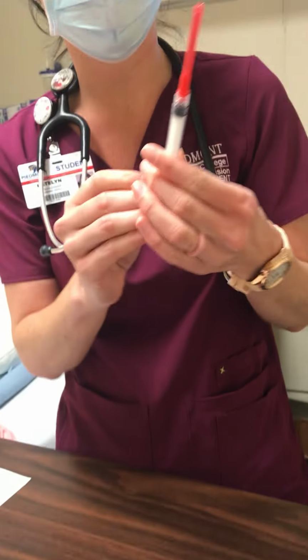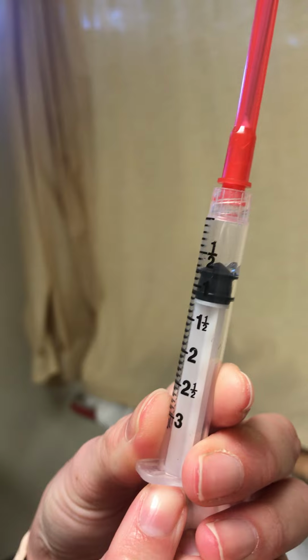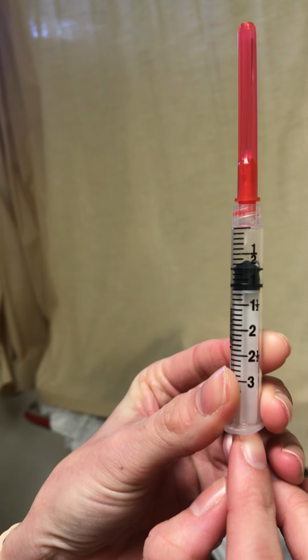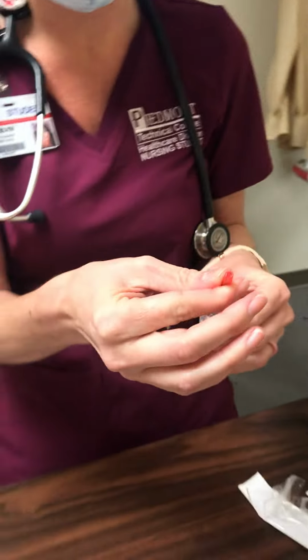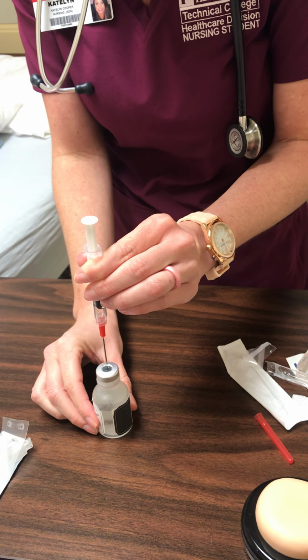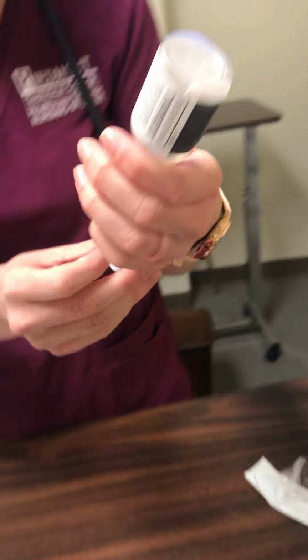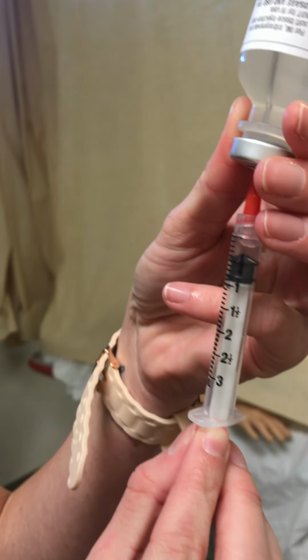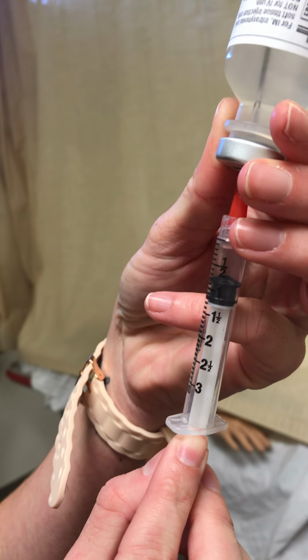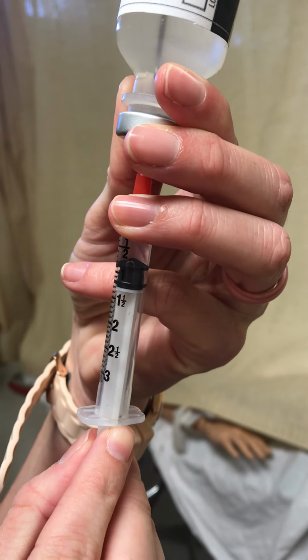And I'm going to draw up 0.8 milliliters of air. So 0.8 milliliters of air. And I'm going to inject that here into the methylprednisolone vial. Inject the air, invert. And I'm going to draw up 0.8 milliliters of the methylprednisolone.